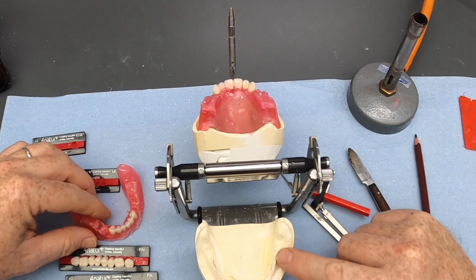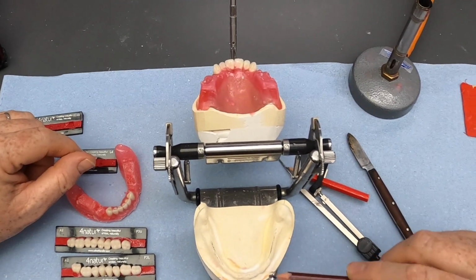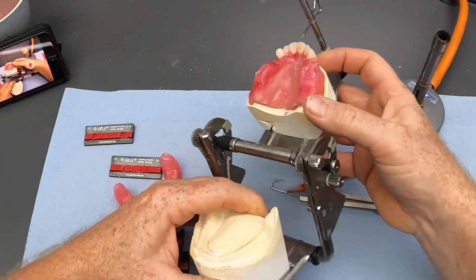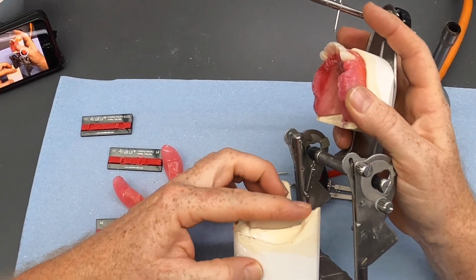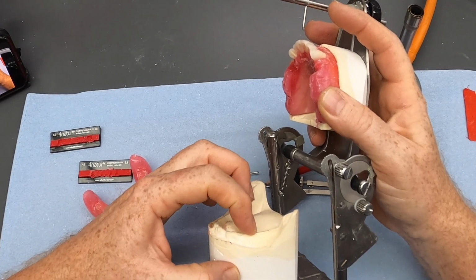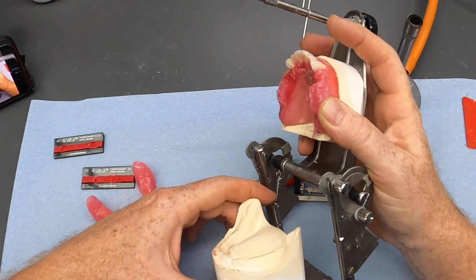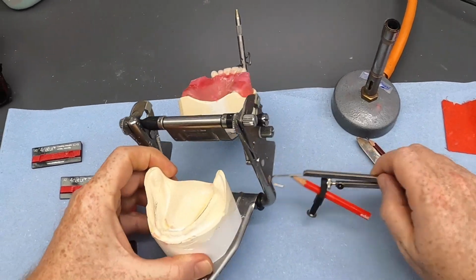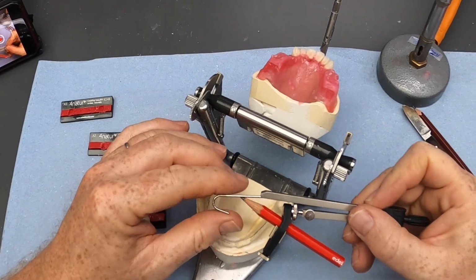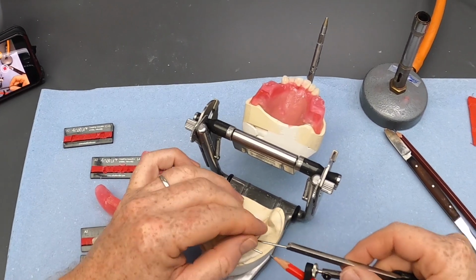Well, we want it over the ridge as we've discussed before, so we've got our pencil line on here, and then we also want to make sure that we're not starting to set the tooth up the incline of the alveoli here. So if there's a hollow in this portion, we want to make sure that we site the tooth in the hollow of the alveolar, and we can take tools like this one to try and find that position.